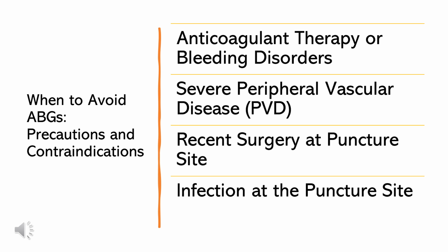If you still require data similar to ABGs, consult with a physician for alternatives. Pulse oximetry or end tidal CO2 measurements may be suitable, although these methods provide limited information in comparison to a full ABG analysis. Always weigh the risk and benefits critically and consult the interdisciplinary team.